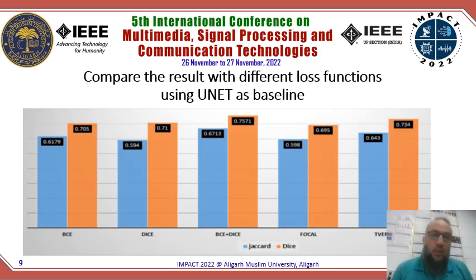It is worth mentioning that we use data augmentation because our dataset is just 163 images. We trained the model on about 113 and kept about 50 images for the test dataset. Before we used data augmentation, the segmentation accuracy was about 60%. After we used data augmentation, the accuracy became higher.